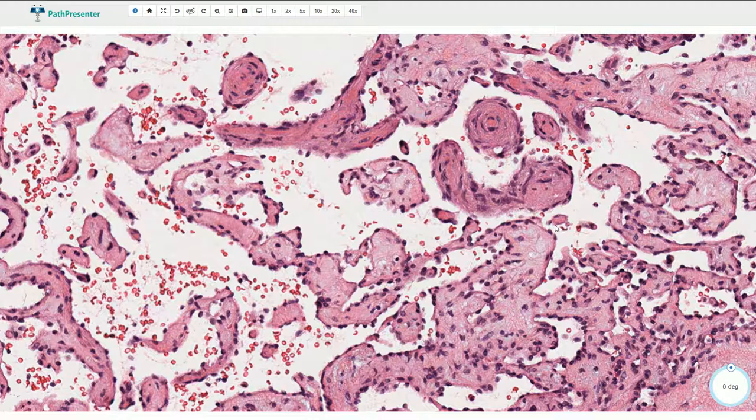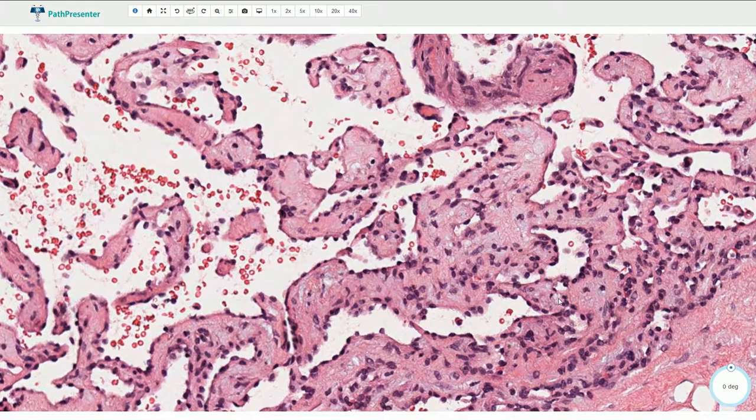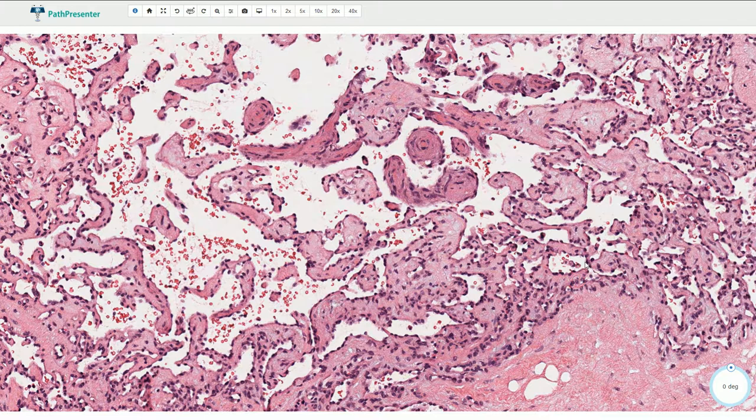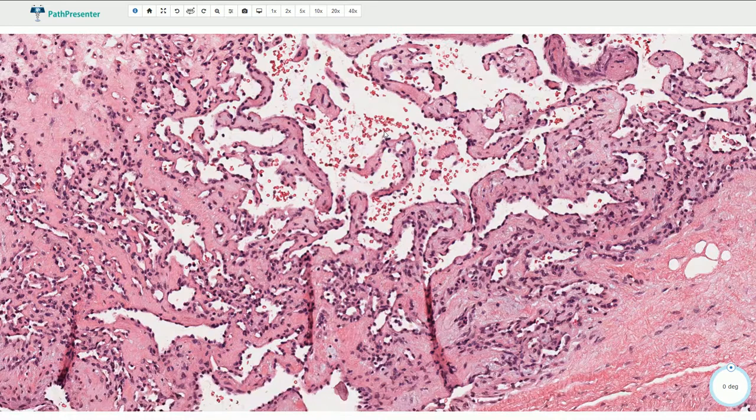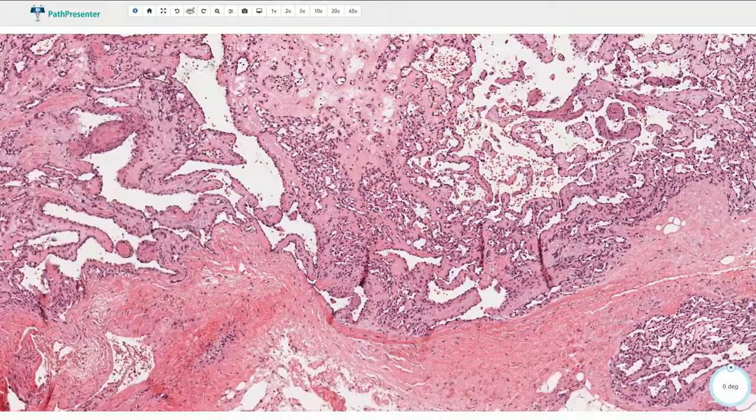There are no cytological atypia, not many mitotic figures, no atypical mitotic figures, and no hyperchromasia or nuclear pleomorphism. We need to be careful not to misdiagnose this as angiosarcoma. The papillary structures can be quite irregular and we see interconnections, but the border is typically well defined and it is not associated with an invasive type of growth.